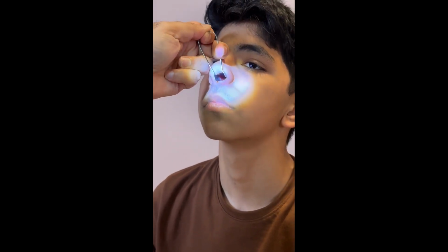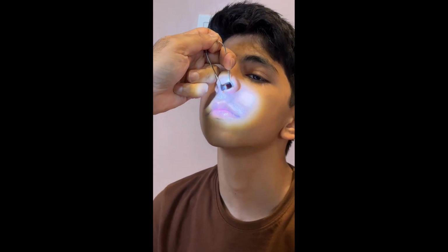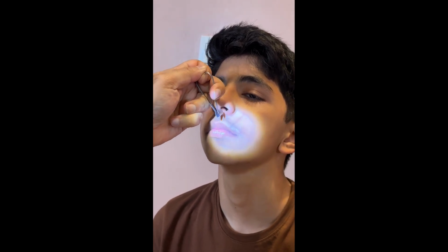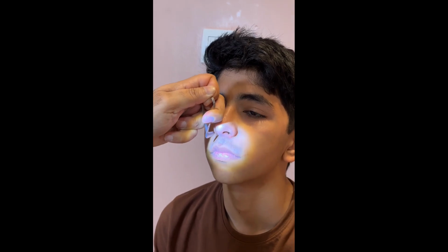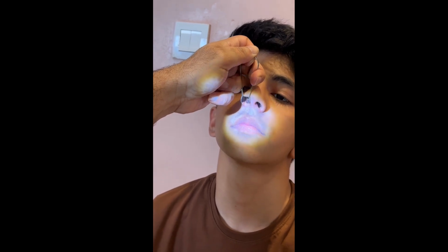So we will insert it like this and see the septum, the medial wall, the lateral wall, roof and floor, and close it, not completely, so the hair vibrissae do not come. But when we are inserting it, it should be properly fully closed like this and visualize like this all.